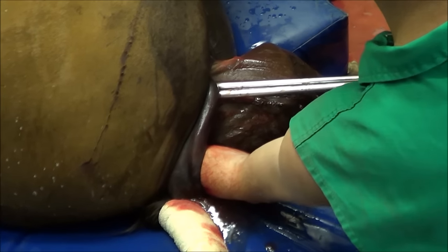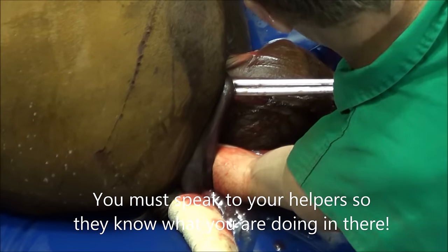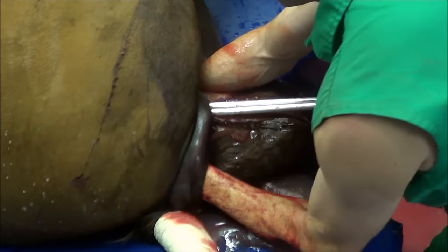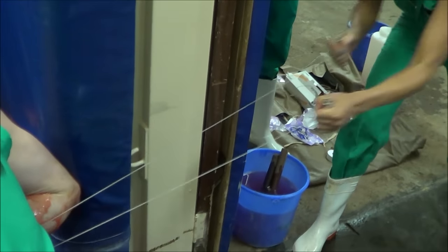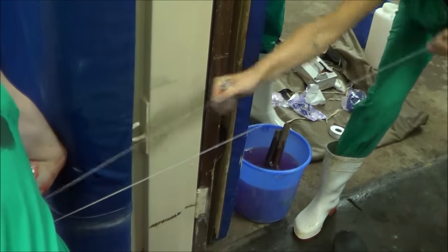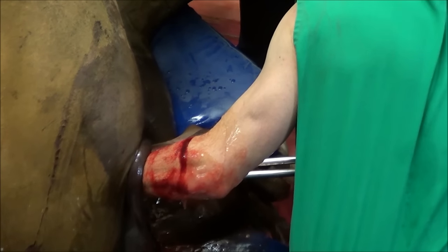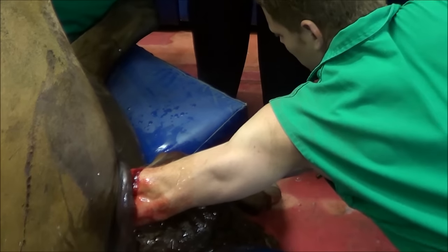You can take a little bit more, a little bit more. It should be quite an easy cut. It's smooth. Do you feel? Not yet. Carry on cutting.